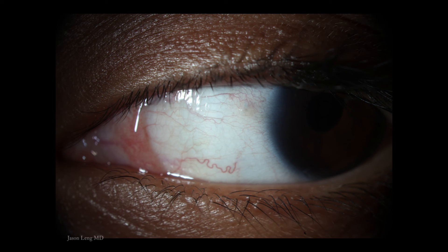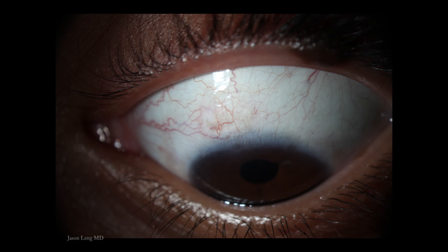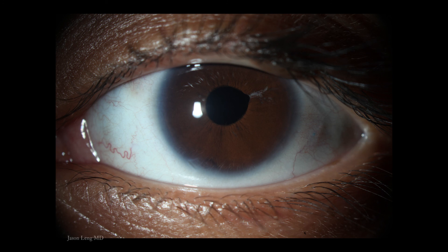After doing 20 or so traditional glued IOLs in the past year or two, I find this new technique to be easier, faster, cheaper, and less invasive — as a result the patient has a quicker recovery with fewer risks of complications.